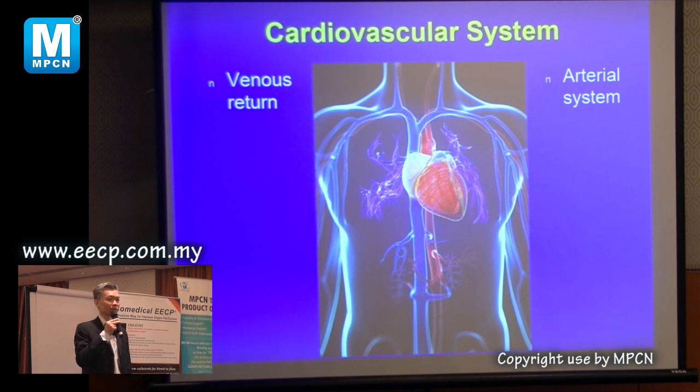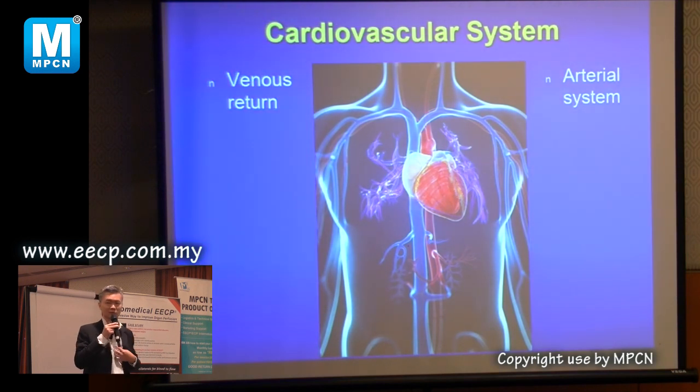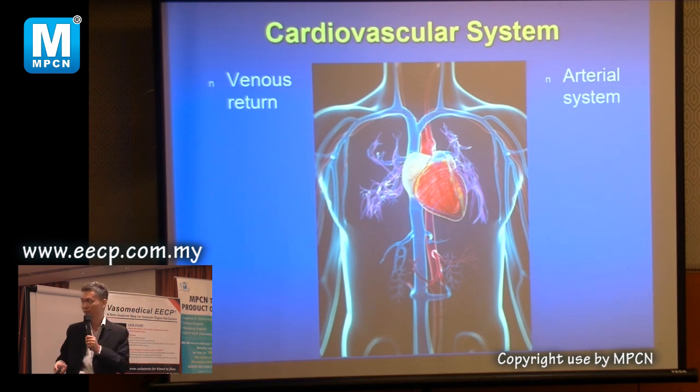Those patients coming to hospital with heart attack, the blood pressure very low, you cannot do anything. You put a balloon into the aorta, not into the artery, just into the aorta, to support the heart with the low blood pressure. So cardiogenic shock, we use that machine. So in the ICU, we use that for patients with cardiogenic shock.